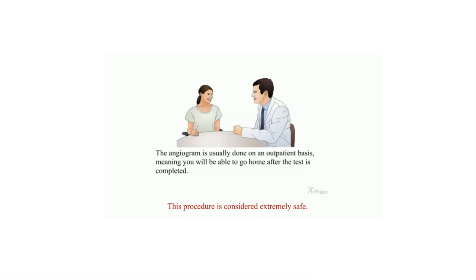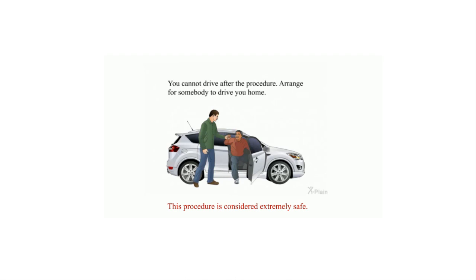Procedure. The angiogram is usually done on an outpatient basis, meaning you will be able to go home after the test is completed. You cannot drive after the procedure. Arrange for somebody to drive you home.